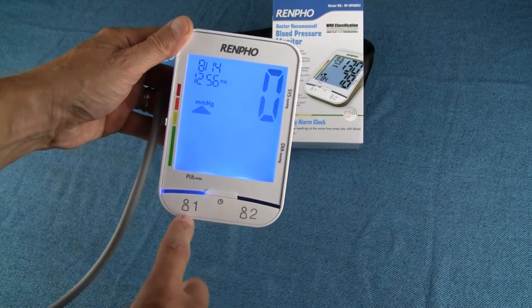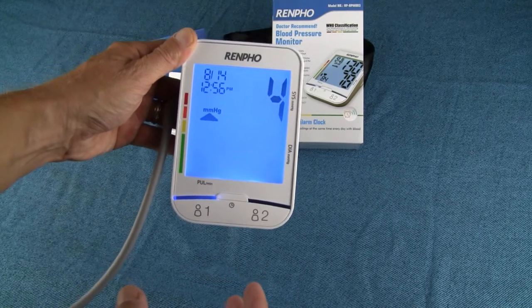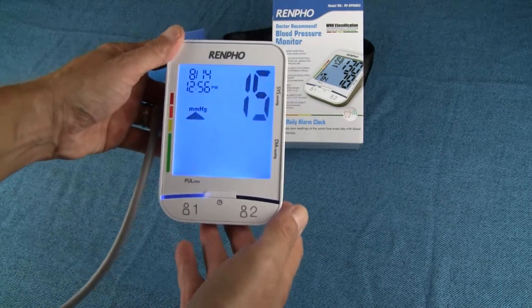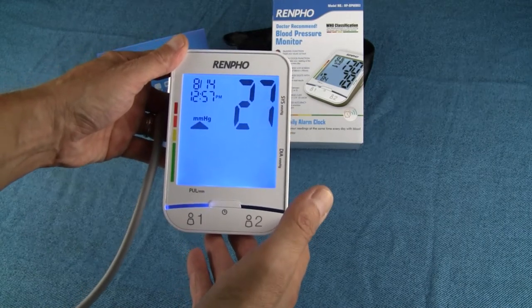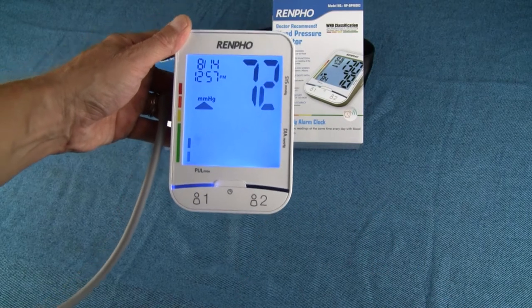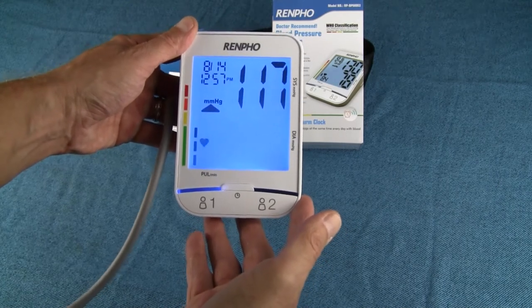There are two users. I've set myself up as user one. It's going to go ahead and just start taking blood pressure. Now, pay attention to the instructions. This test I'm doing right now is not going to be a good one because I'm standing up, I'm talking, I'm not holding still. Make sure you follow the instructions. Sit down in a chair, feet flat on the floor, with your arm at the same level as your heart, palm up, and relax while you take these measurements. Otherwise, you are going to get an erroneous reading. I'm doing this in real time just so you can see how long it takes.